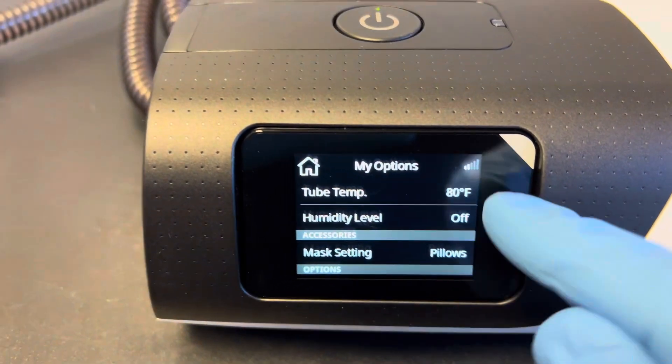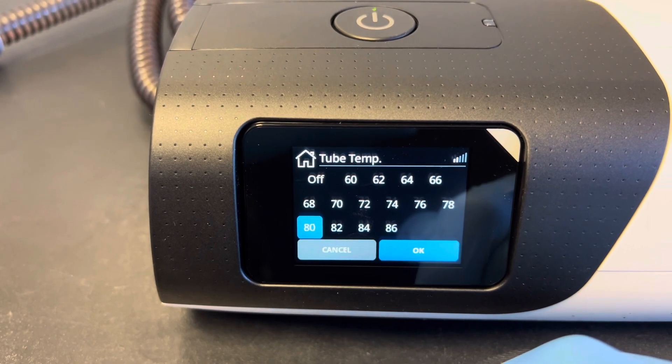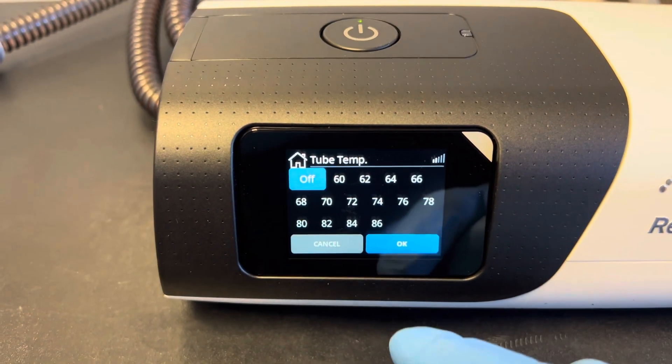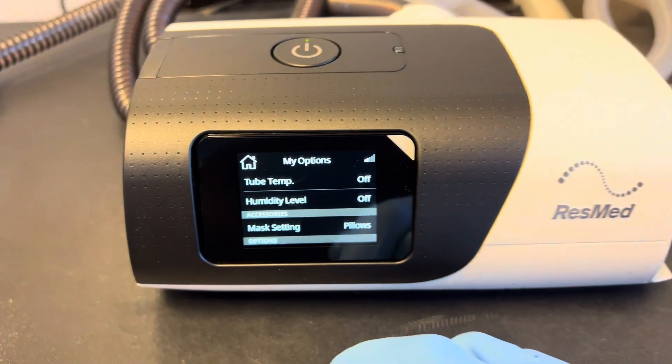At this point, if you want to continue to use tube temperature you're welcome to leave this on — it'll just heat the air as it travels through the tube. A lot of folks, if they turn off the heating element inside the tank, choose to turn off the heating element inside the hose as well, that way you're just getting room temperature air being blown to you. Press OK again — now the machine's ready to use without water.